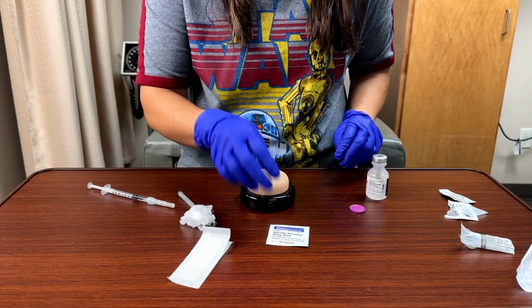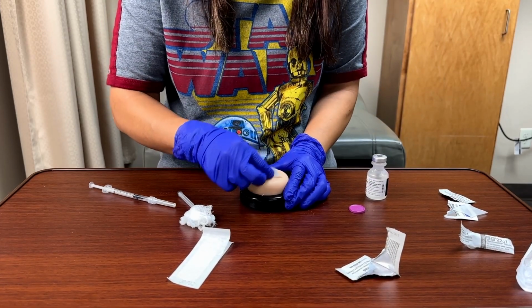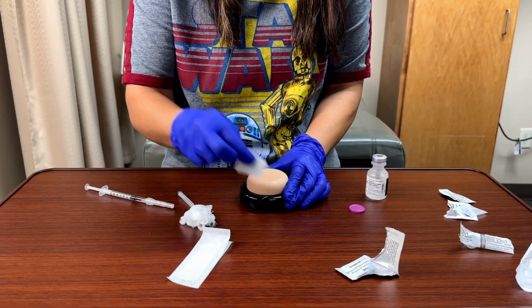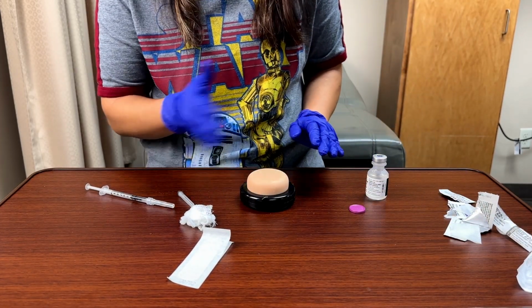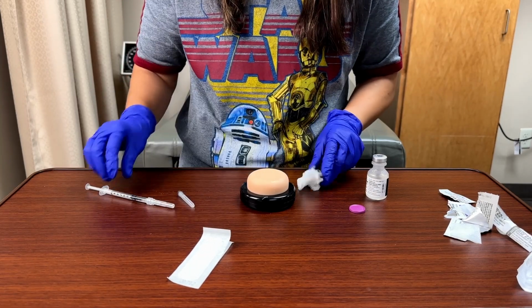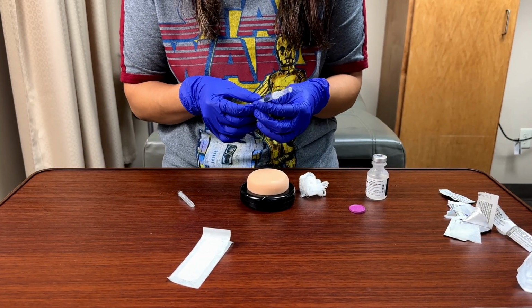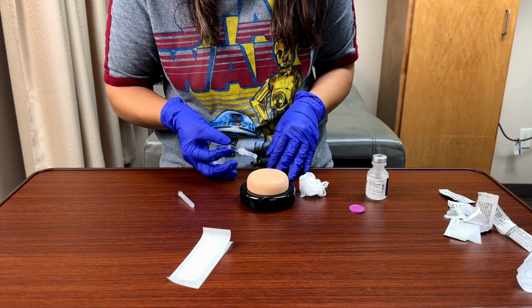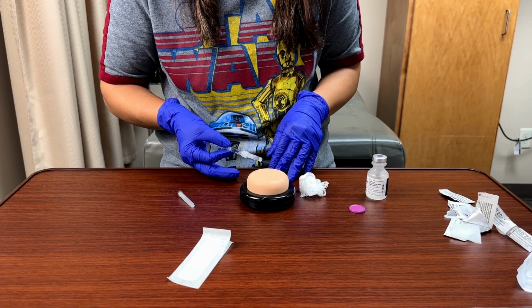All right, I have my skin. Let's prep our skin. So I'm going to take this and I'm going to gently rub it back and forth on the skin to clean it up. I'm going to let that dry naturally. I'm not going to blow on it. I'm not going to waft it. Now, the angle of an intradermal injection is almost like putting in an IV. It is a 10-degree angle.